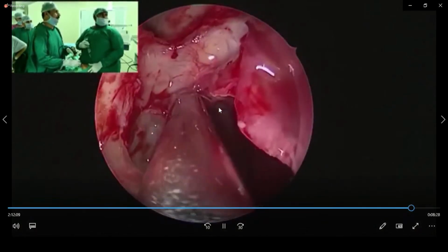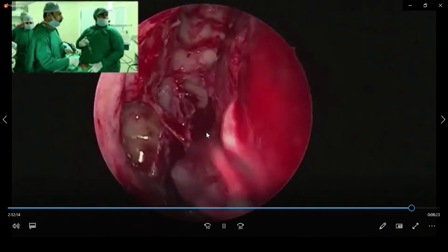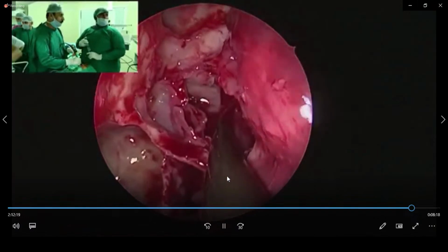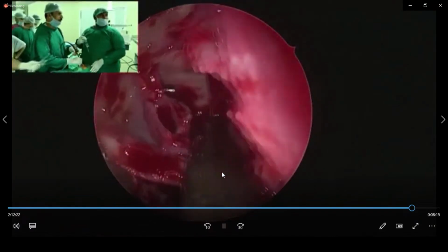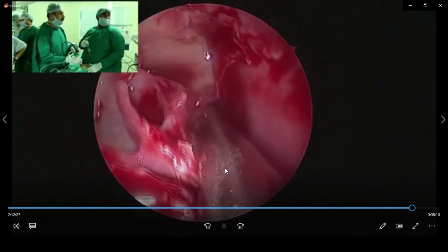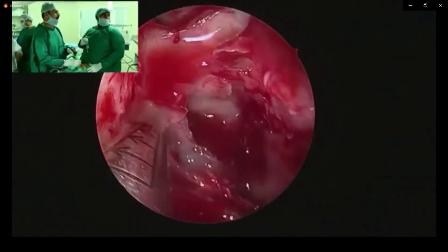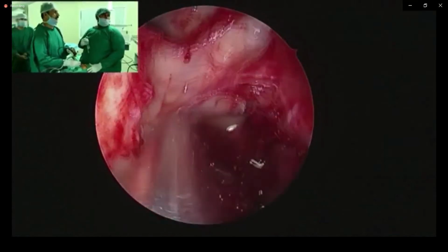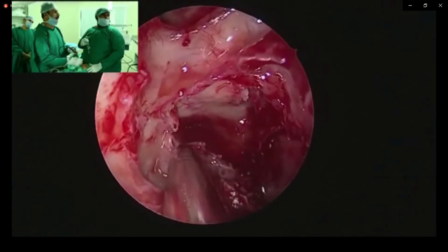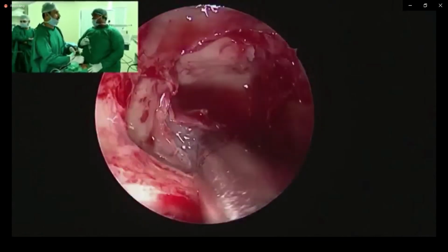See this, completing the posterior cell ethmoidectomy, staying anterior to the sphenoid sinus ostium. That's the sphenoid sinus ostium. And then finally widening the sphenoid sinus. See the ostium. Staying anterior, you can remove anything. Widen the septations. Your optic nerve and carotid artery cannot come anterior to the sphenoid sinus ostium. This is a very, very safe way of doing the posterior ethmoidectomy.